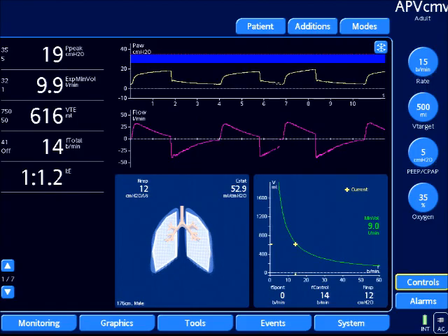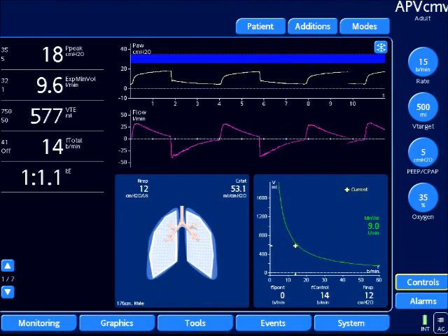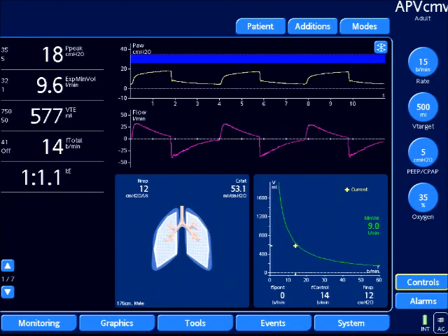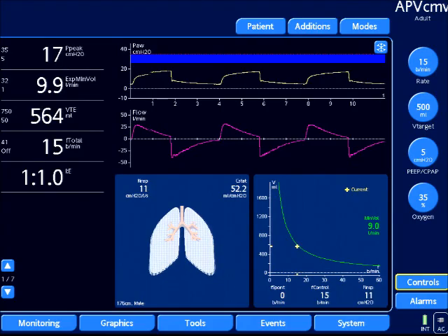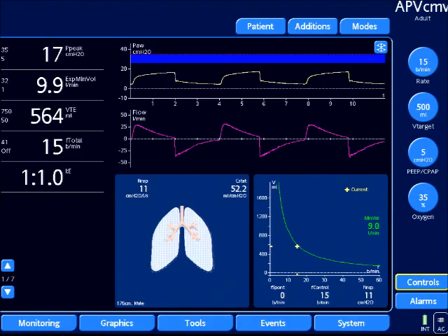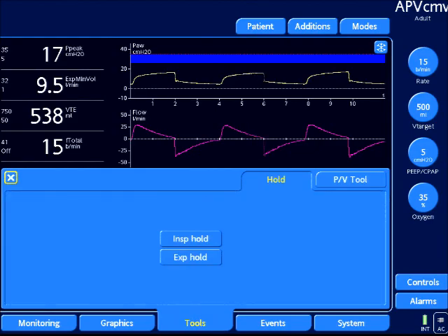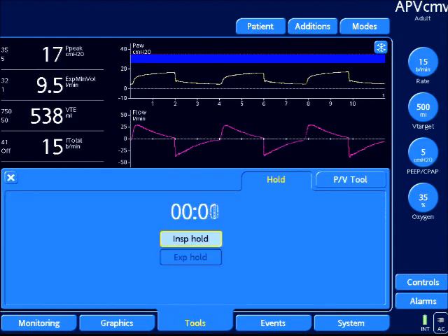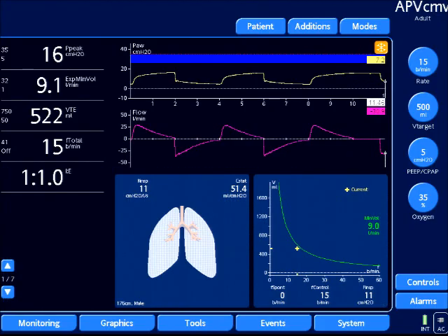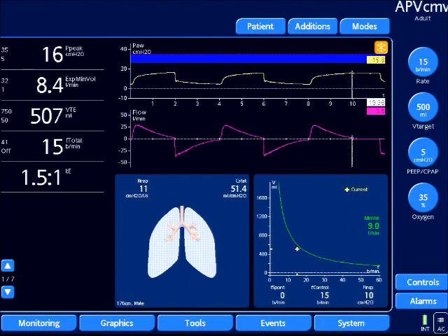I'm going to increase inspiratory time a little more, trying to get to that fully decelerating state where my inspiratory flow returns to baseline. Looking at my waveform, I'm pretty much there. So I'm going to do the inspiratory hold maneuver again and check out the plateau versus the peak pressures — which should be pretty much equal at this state.